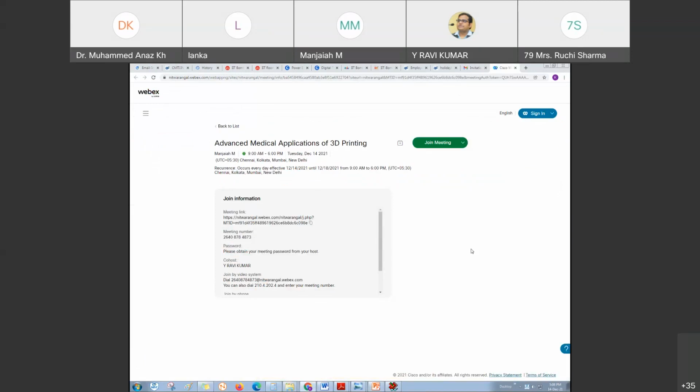Sir, one query is in the chat box. What is the full form of KVP they are asking? KVP, kilovolt peak. Kilovolt peak means the maximum voltage you are getting in the signal during scanning.